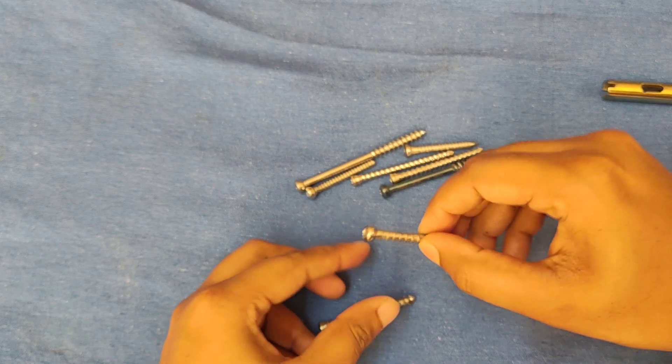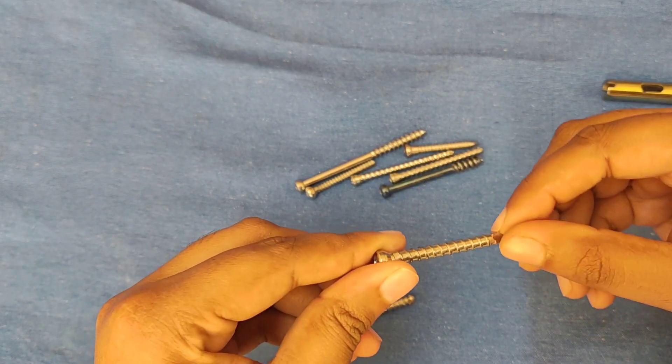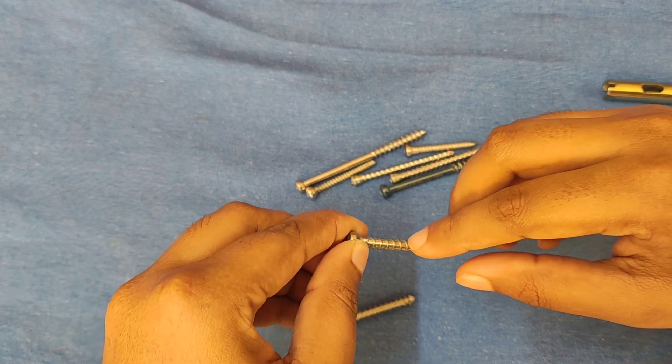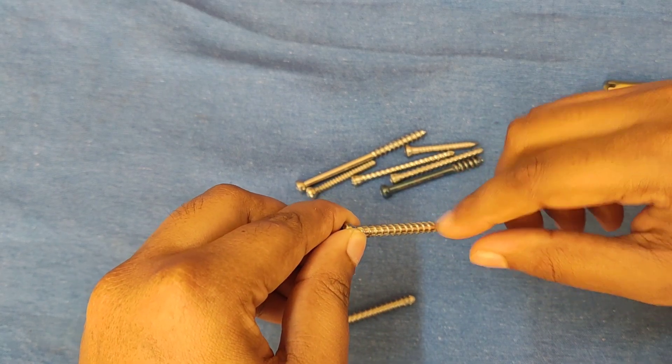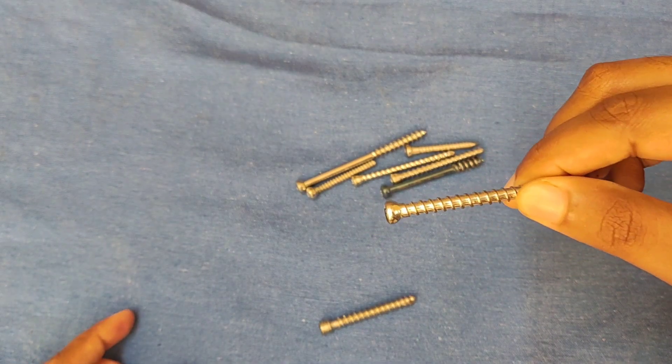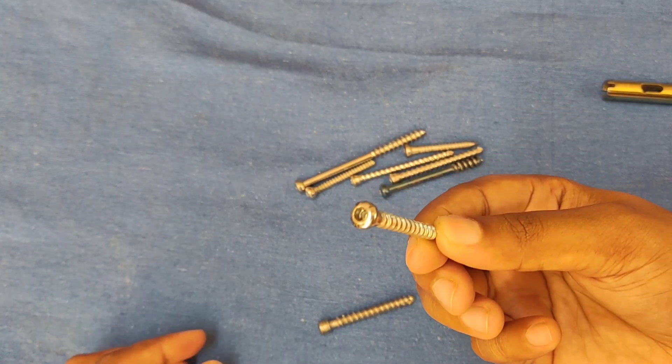Now we will discuss the difference between a cortical and a cancellous screw. Cortical screw has more core diameter and less depth of thread. It has a lesser thread diameter, lesser pitch, and a simple tip.